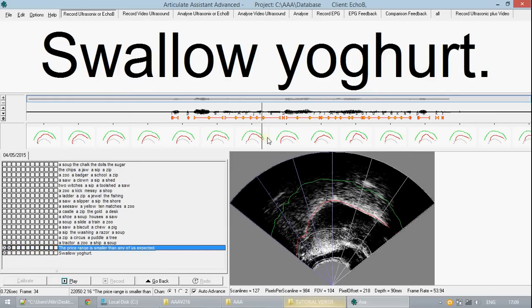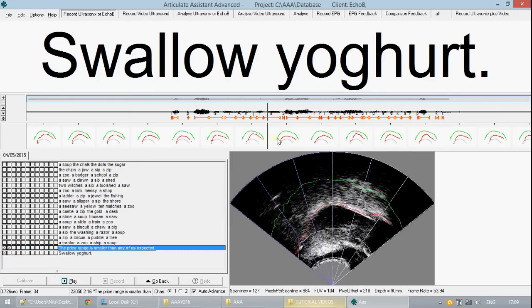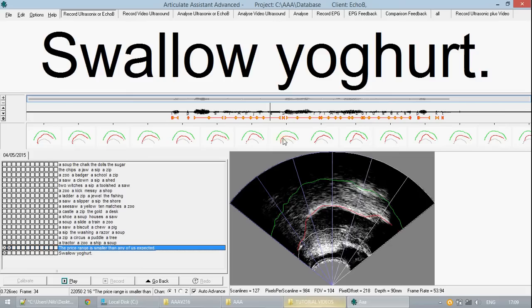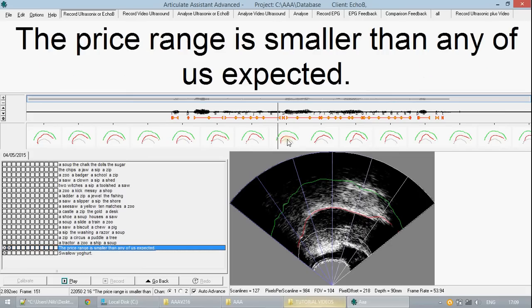This concludes the tutorial for editing annotations and editing splines. Further help is always available in the documentation. If you want to learn about recording your own data please see subsequent tutorials.